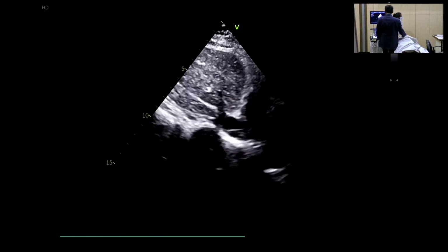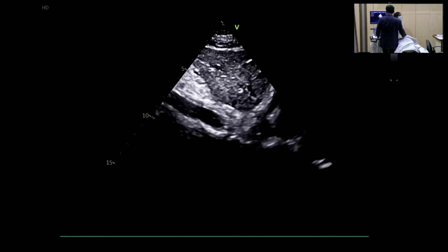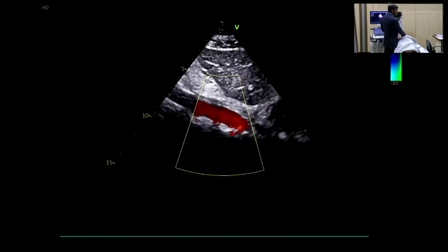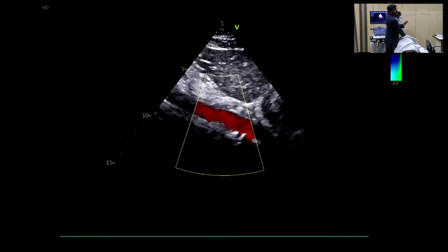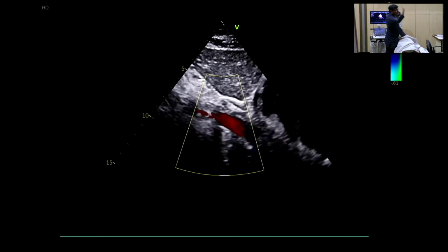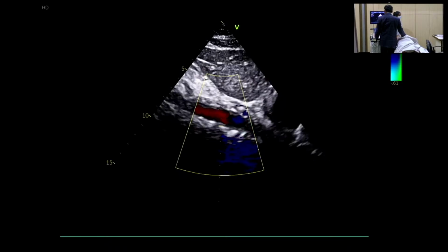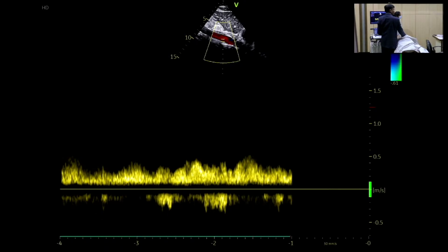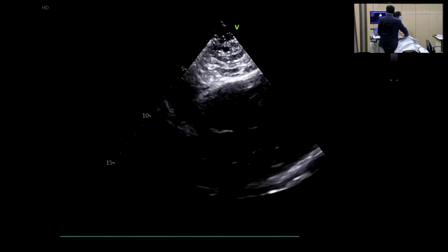So again, IVC, and now I will show descending aorta color, which I was demonstrating, just color. See this. Red तो रहेगा ही. Non-pulsatile, staying in diastole. So your eyes have to be trained that this is not a systolic flow. This is staying in the diastole. Continuous flow. You understood? Yes. Now Doppler again. Confirmed? Yes. Good. So you made the diagnosis already.